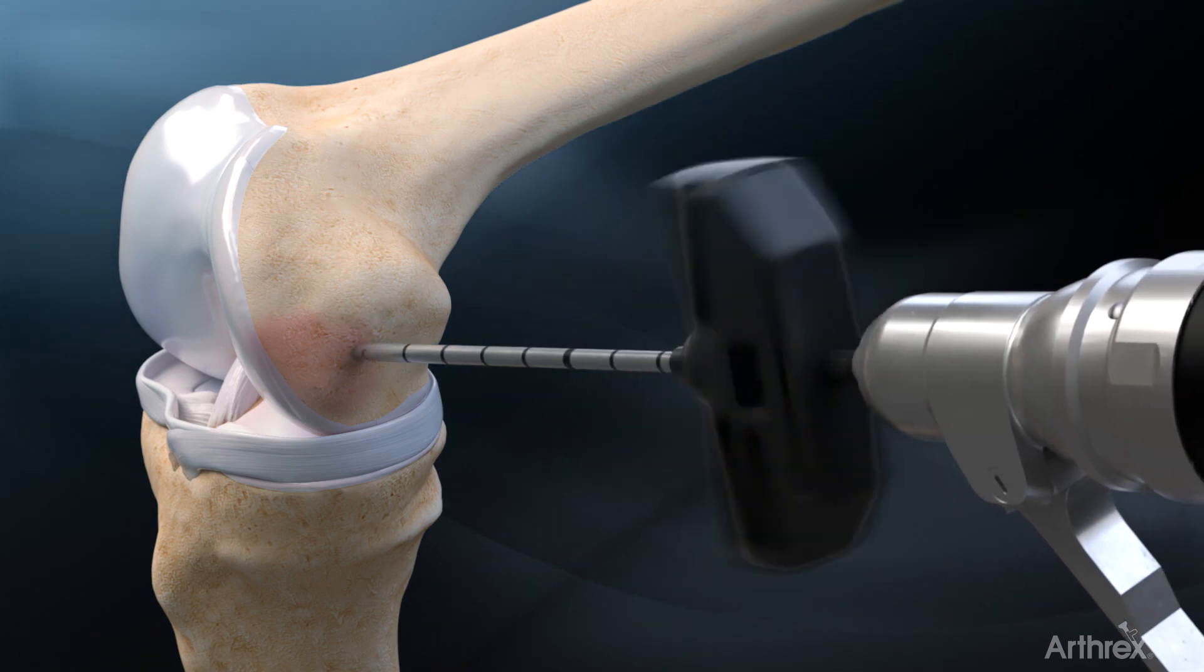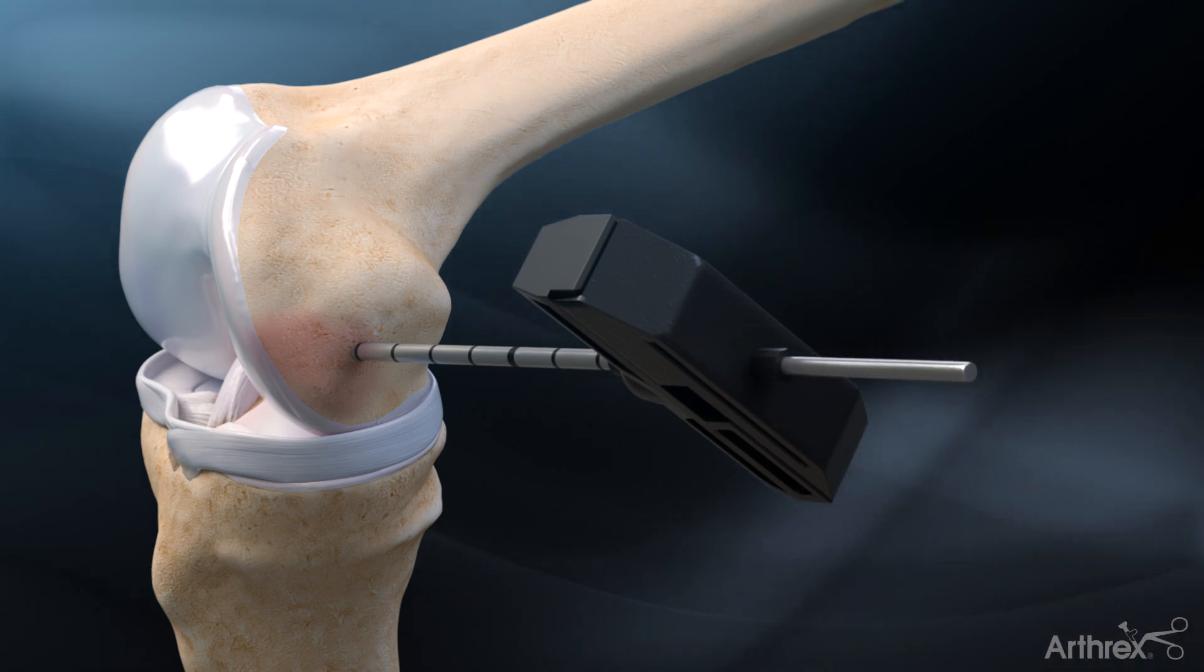Insert the delivery cannula utilizing fluoroscopic guidance to ensure the cannula is positioned appropriately into the subchondral bone.